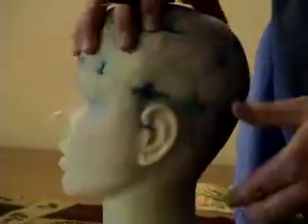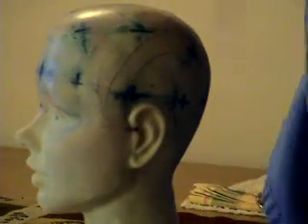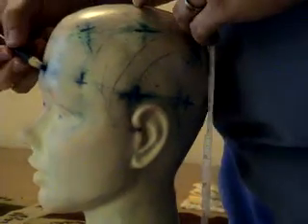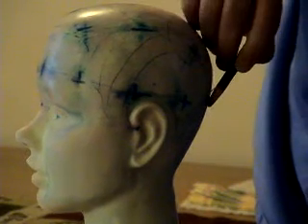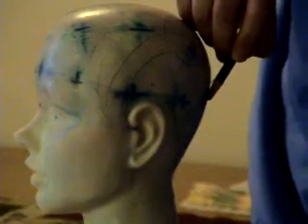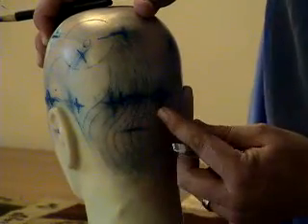The next step is to take your tape measure, and you start at the front of the head at FP1, and you go all the way across to the back of the head, which is now known as O1. We have O1 and O2.